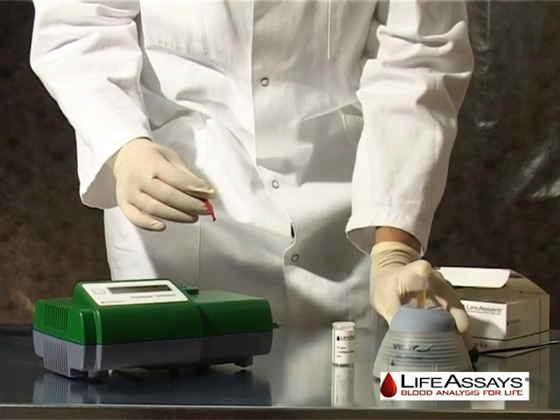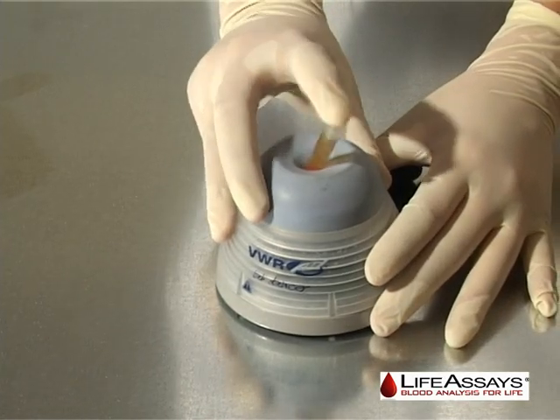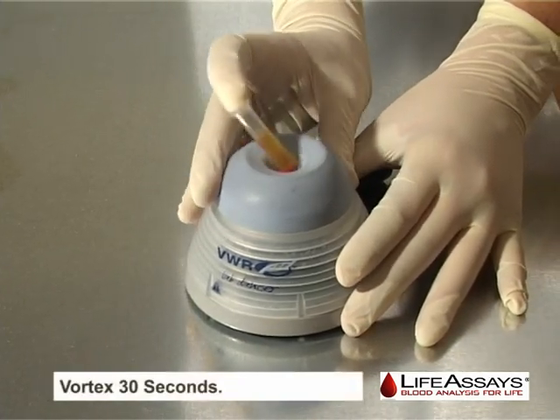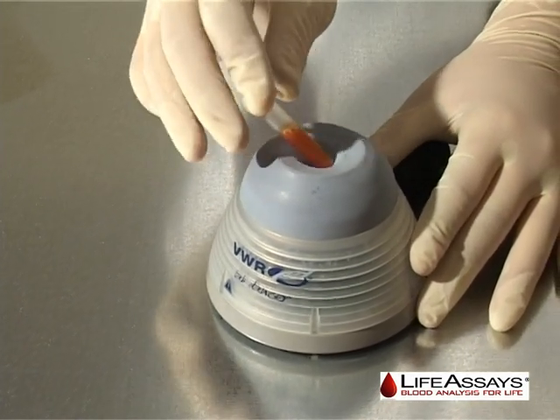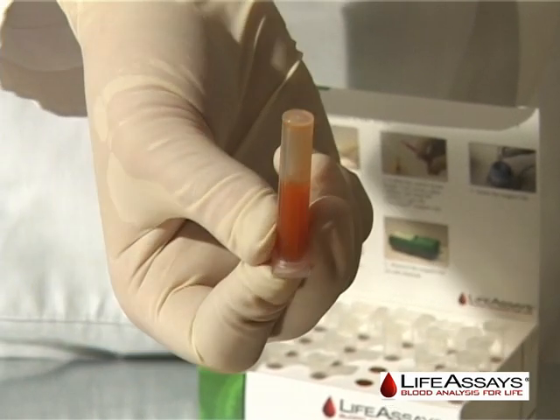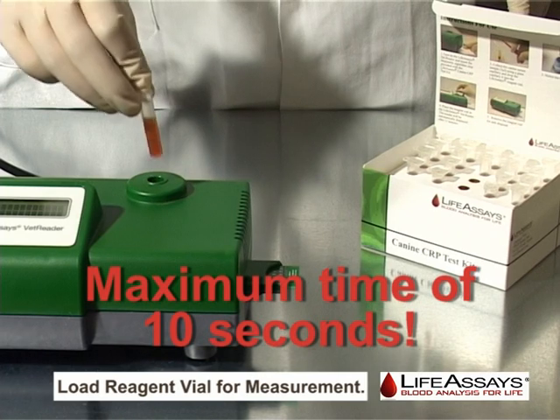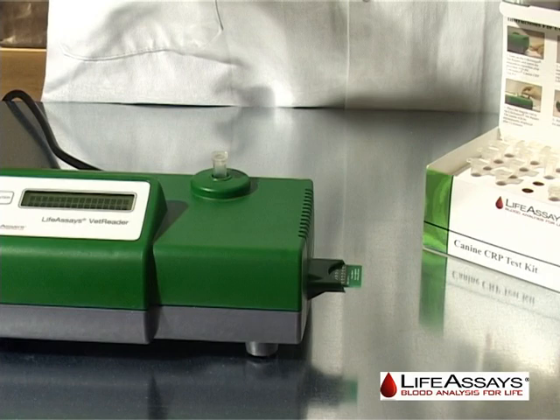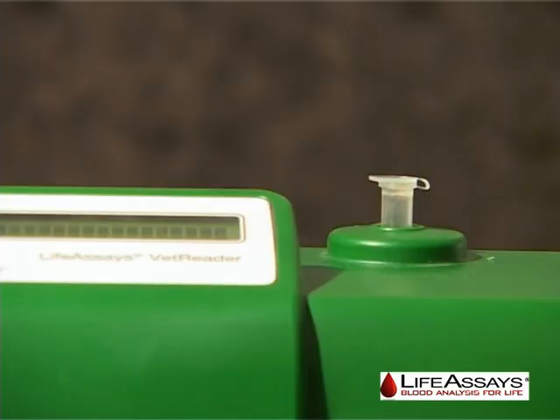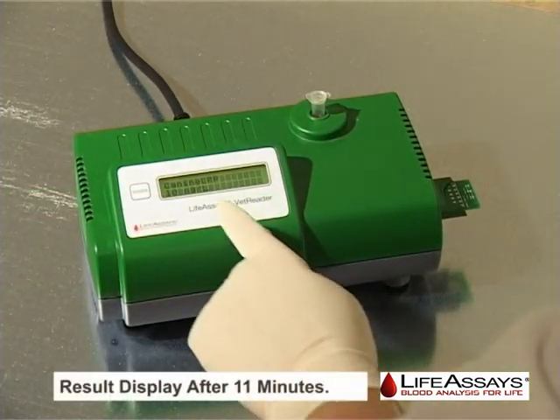Once unloading the reagent vial, the instrument will switch automatically to vortex countdown after 5 seconds. Vortex the reagent vial for 30 seconds. After the vortexing time has run out, the display shows insert vial 10. This means the user has 10 seconds to confirm the pellet is completely suspended and then load the reagent vial back into the instrument. The user may now leave the instrument. The measurement will be performed and the result displayed after 11 minutes.